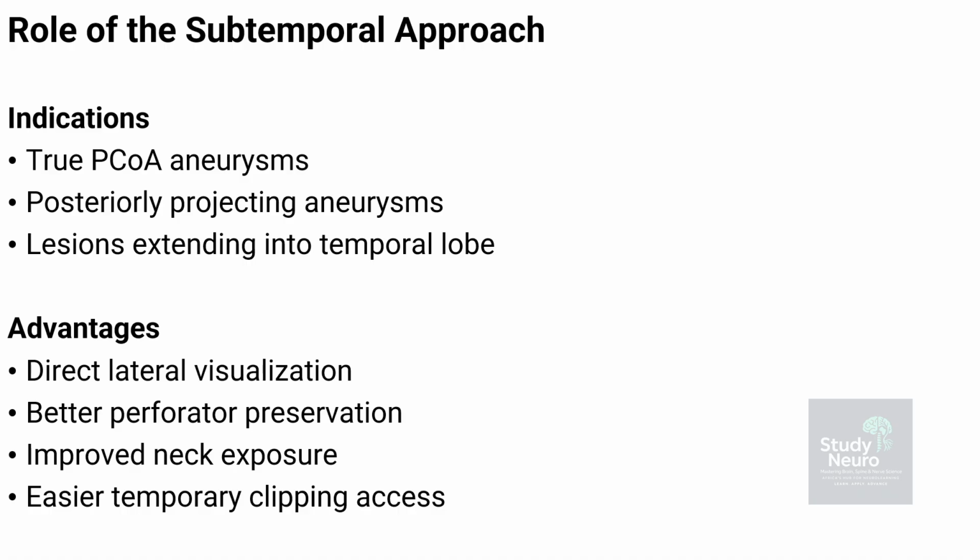It also allows easier temporary clipping and often provides a more favorable working angle for dissecting around the posterior aspect of the internal carotid artery, especially in complex or posteriorly directed aneurysms where the standard approach becomes restrictive. Access becomes simpler in the right case.